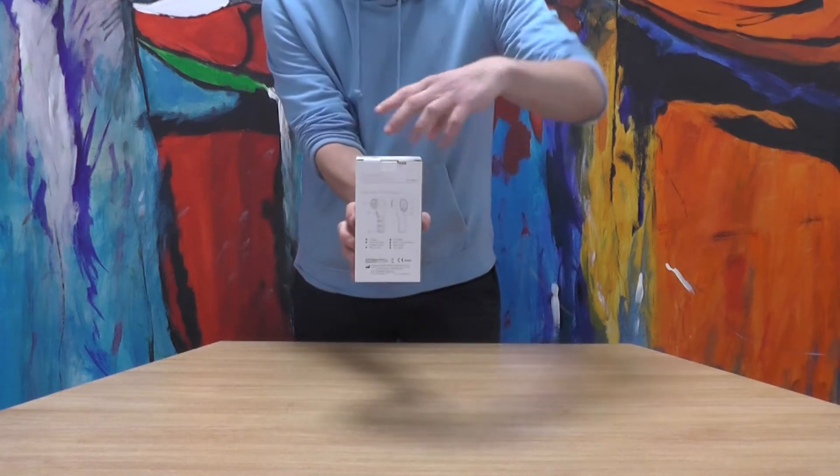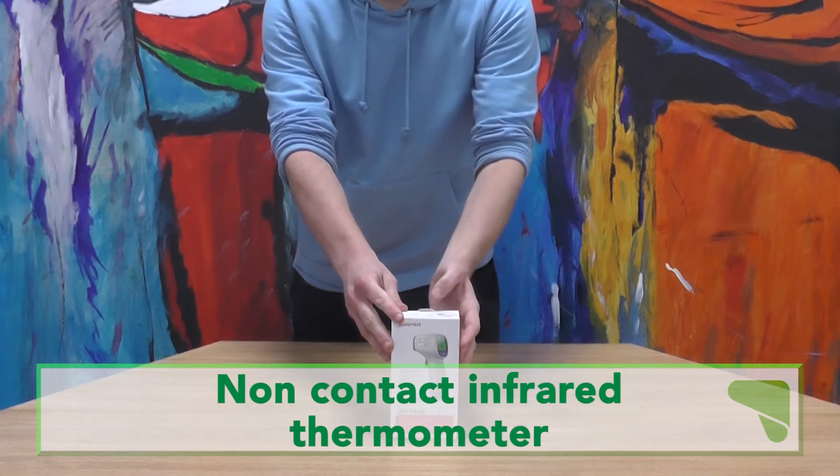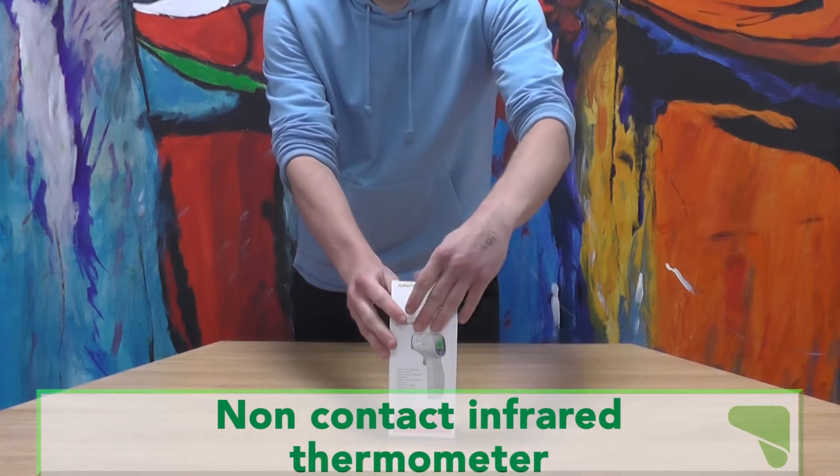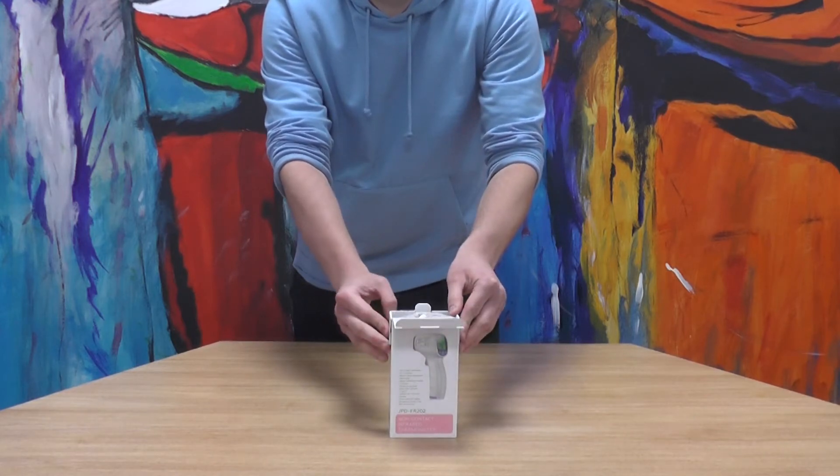Our non-contact infrared thermometer is accurate and simple to use, allowing you to take the non-invasive temperatures of residents and guests. The thermometer is able to measure both person and room temperature.